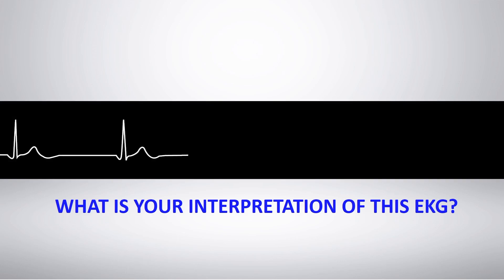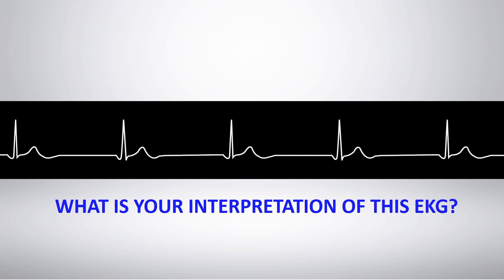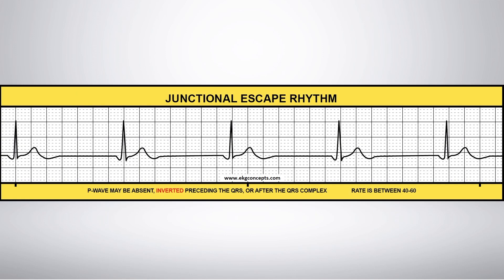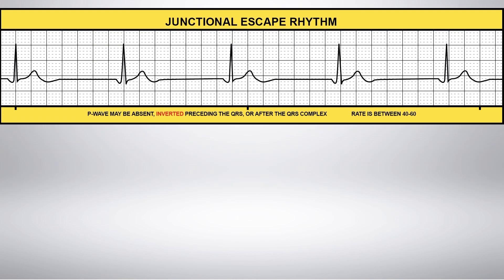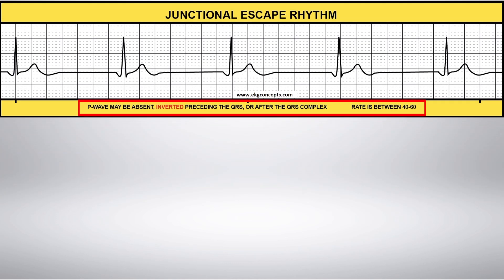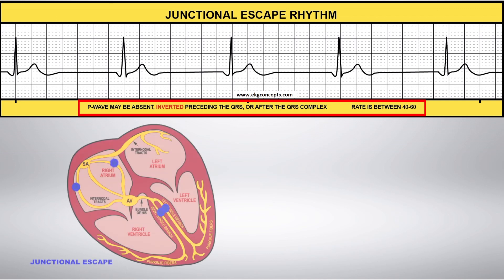What is your interpretation of this EKG rhythm strip? Junctional Escape Rhythm originates when the AV node or the tissue surrounding it takes over as the primary pacemaker. The heart rate is between 40 to 60 beats per minute.